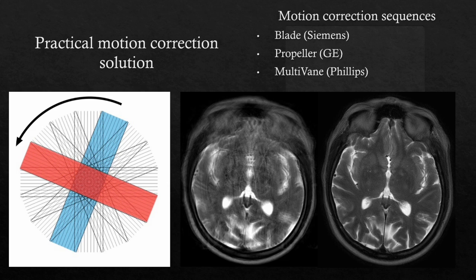We use these quite regularly for collecting fast data, and even if we're really struggling to get some still images, even just getting a few sequences using this technique is really valuable to have some idea of any diagnostic or physiological situation that's going on. So it's really, really handy to have in your arsenal.